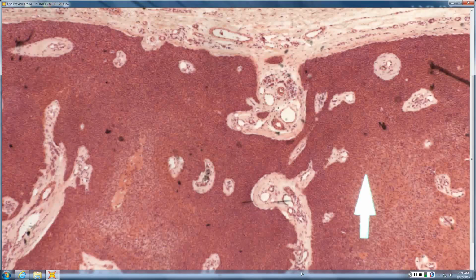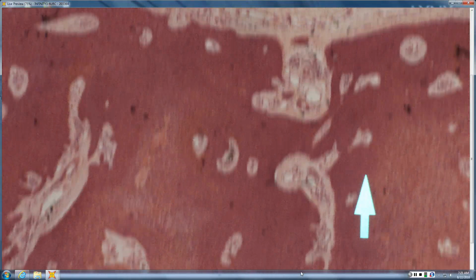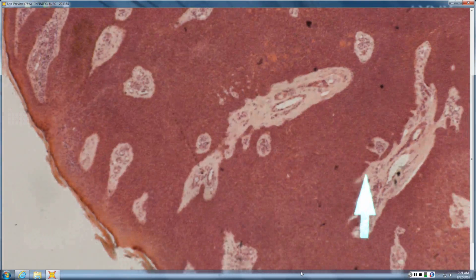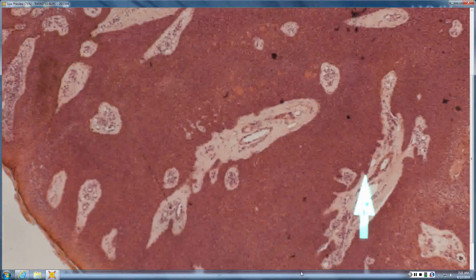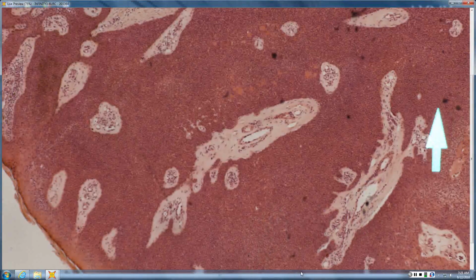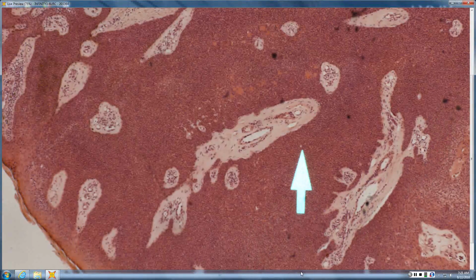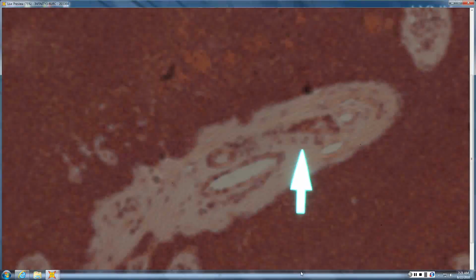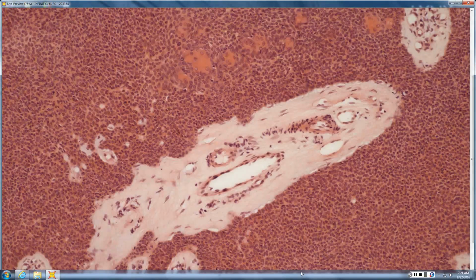And when you get in a little closer, all those cells are very nice, cuboidal, evenly spaced, all lined up. And even from this distance, you can see little tiny duct formation that really helps clue you in as well. So those little ducts there. Little ducts. Okay.